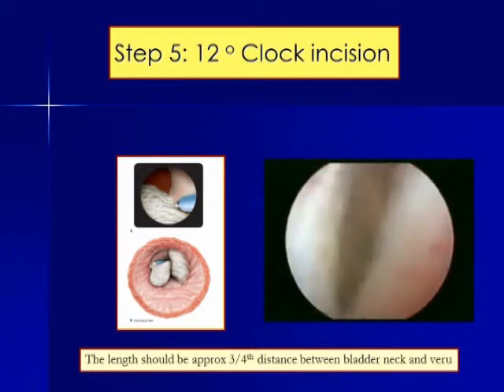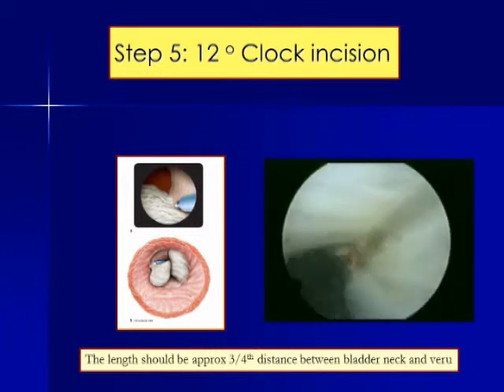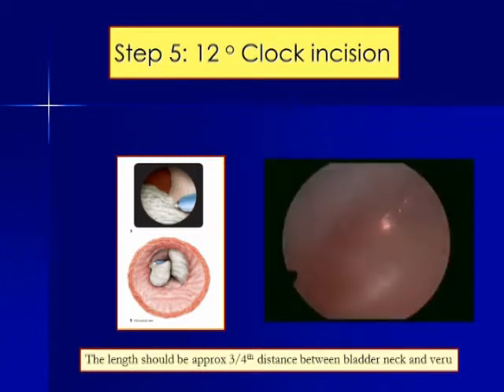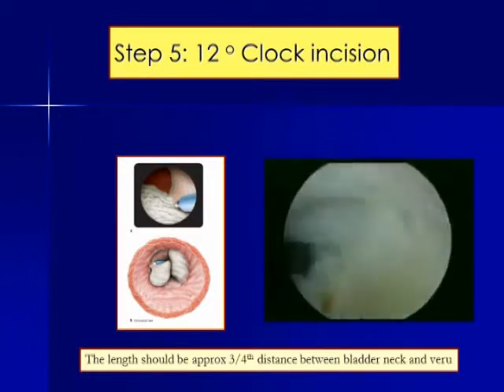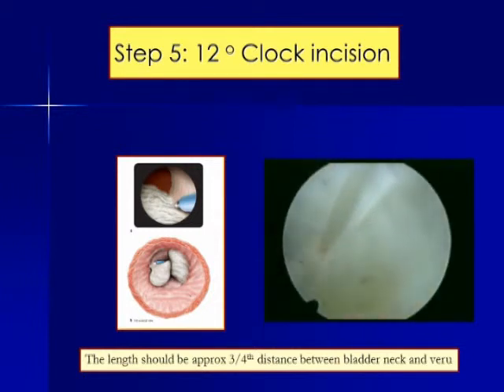After this is done, then 12 o'clock incision is taken. There is hardly some tissue there, so 1 or 2 incisions usually suffice. And once we take an incision, we have to follow the capsule and bring the adenoma down, staying on the capsule. As we keep on separating the adenoma from the capsule, we can see the adenomatous tissue falling down. We can see here above the capsular fiber circular and the adenoma dropping down. And the length of incision keeps on increasing as we approach down and down to take care of the apical tissue.